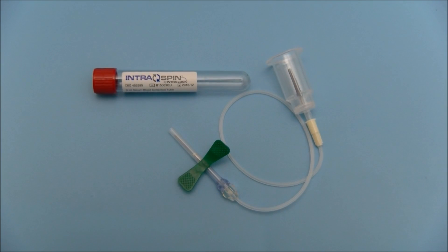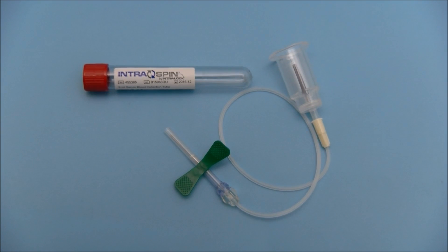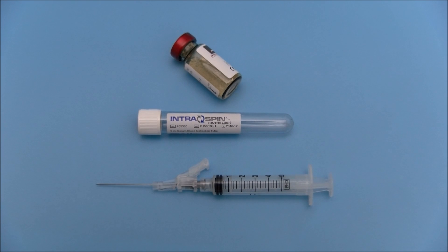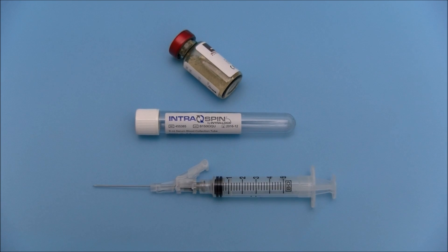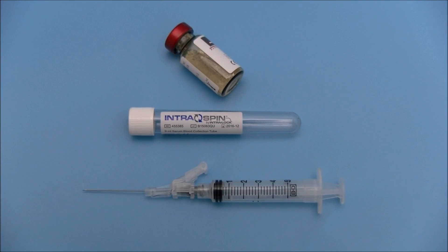Red top Intraspin tubes are used to fabricate LPRF membranes. White top Intraspin tubes are used to harvest uncoagulated plasma that will be added to the bone graft to fabricate PRF blocks.